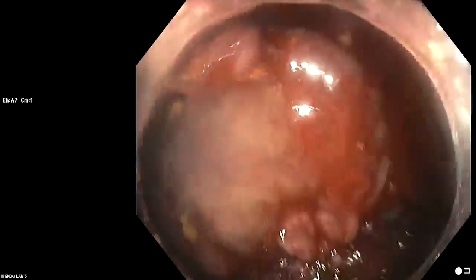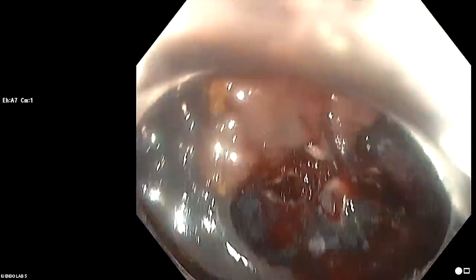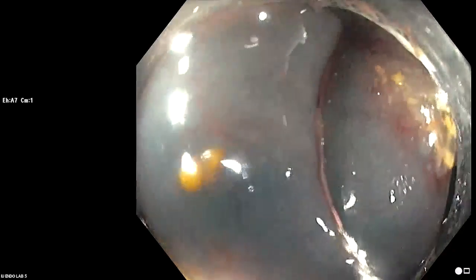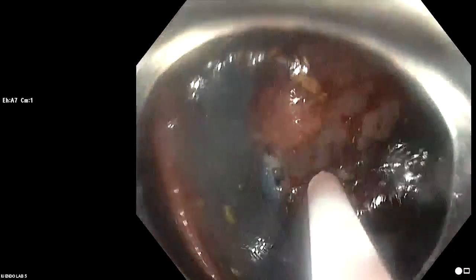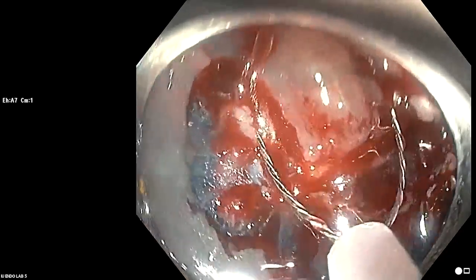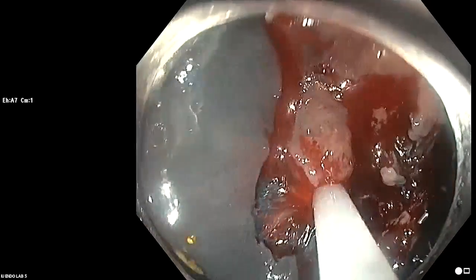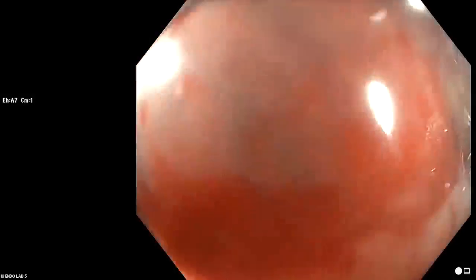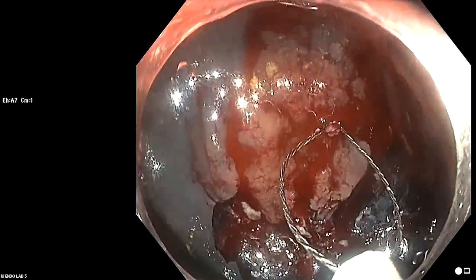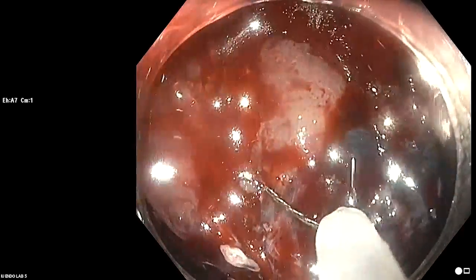And now I just pulled that through a little bit. That should maybe give us a bit of a submucosal cord. That's the first time I've had to pull the snare through the lesion. And I think it's probably because there's a little bit of fibrosis in the middle. And you notice I'm not trying to get incredibly greedy here with the size of pieces that I'm removing, because that kind of helps to prevent the snare from stalling. If the snare stalls and you pull it through, that's okay, but it's not quite as smooth.